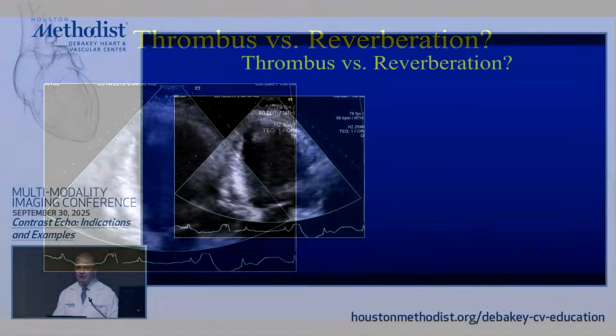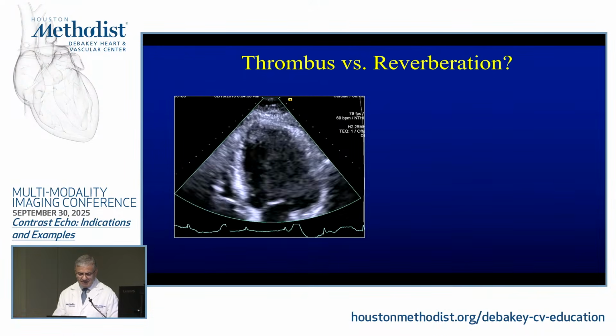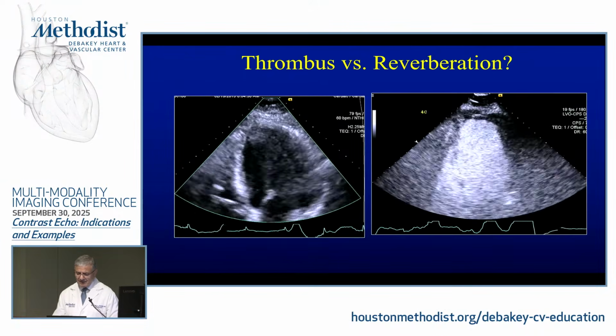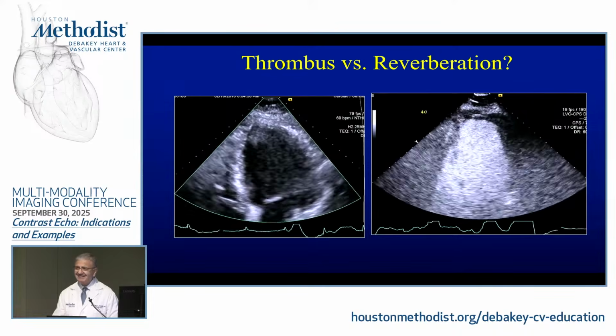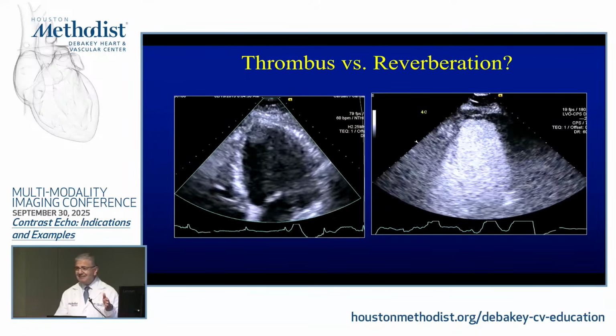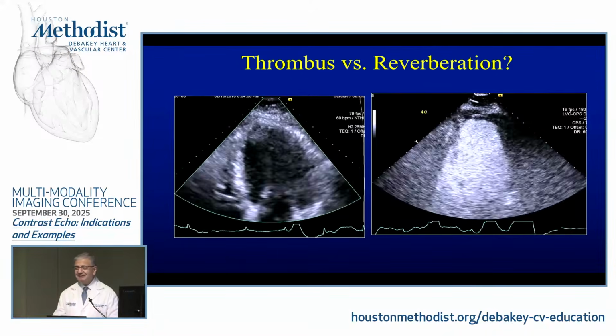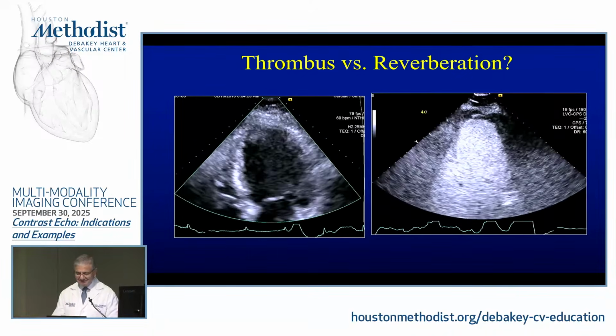I mean, I would say thrombus, all of you. LV function is reduced, LV is dilated. Yeah, thrombus. I don't agree with you. The apex is akinetic. Yeah, but the apex is akinetic. So I mean, that's the problem at times, in the right circumstances, right? So you're pushed for, okay?